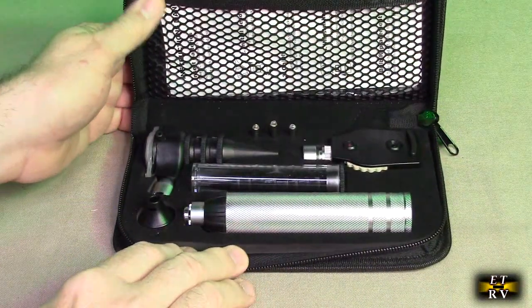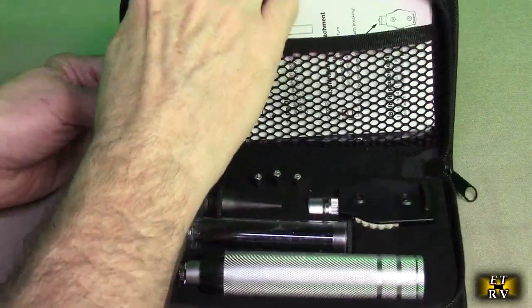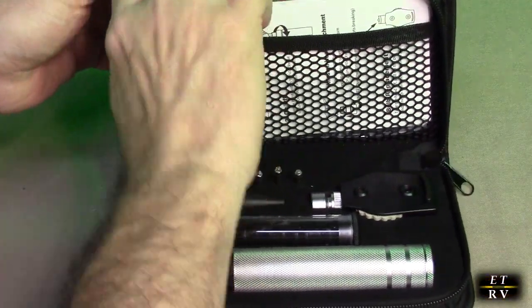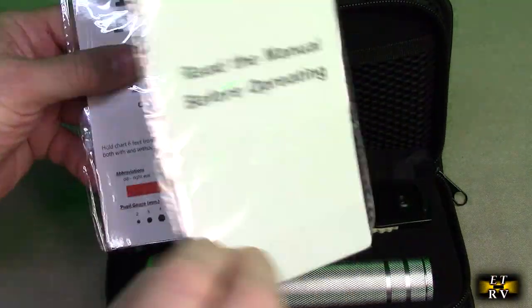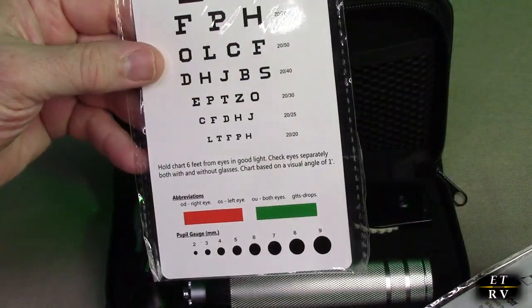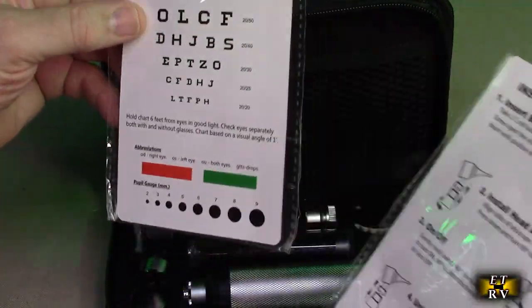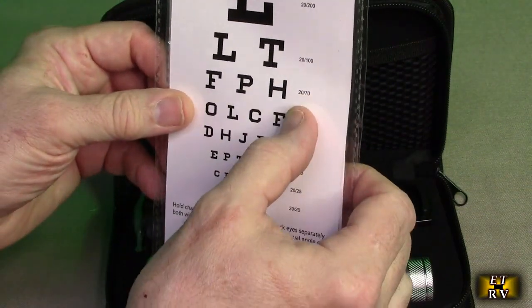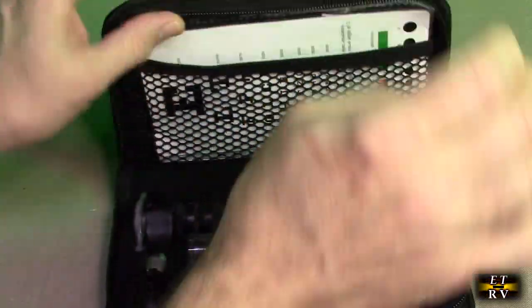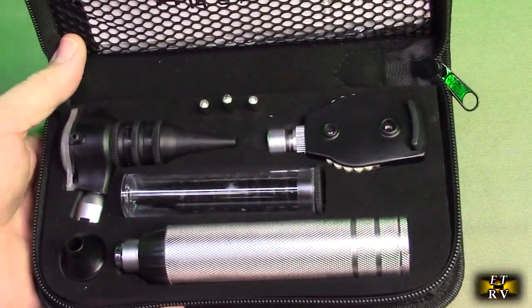I unzippered it and you can see what's inside. There's some documentation — basic instructions — and a nice eye chart which you put at six feet away. It has all the different ratios for 20/20 vision and shows how vision gets worse, demonstrating how to test vision. Here's the unit itself, all packed safely and nicely.